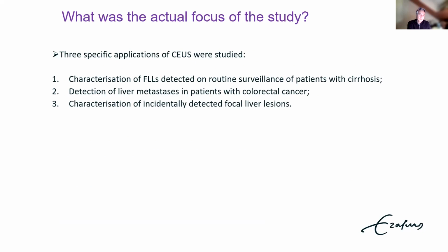For this particular study, there were 3 specific applications chosen, not by us, but actually by a group in NICE, who at the start identified the different ways in which contrast-enhanced ultrasound could be used. And you can see that there were 3 very different applications that we had to assess. The third one was the one that I was involved in particular, and that's what I want to highlight with you.